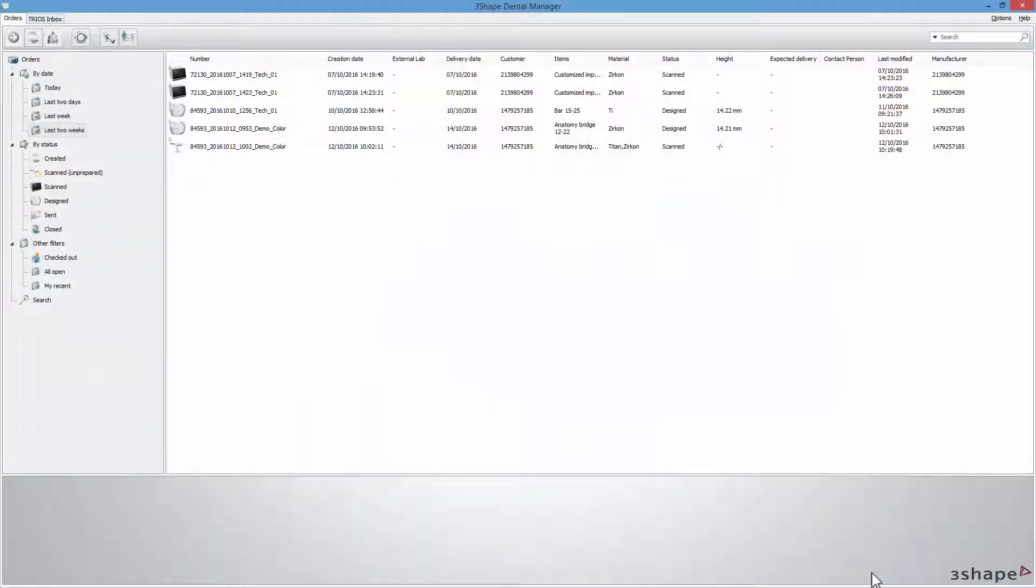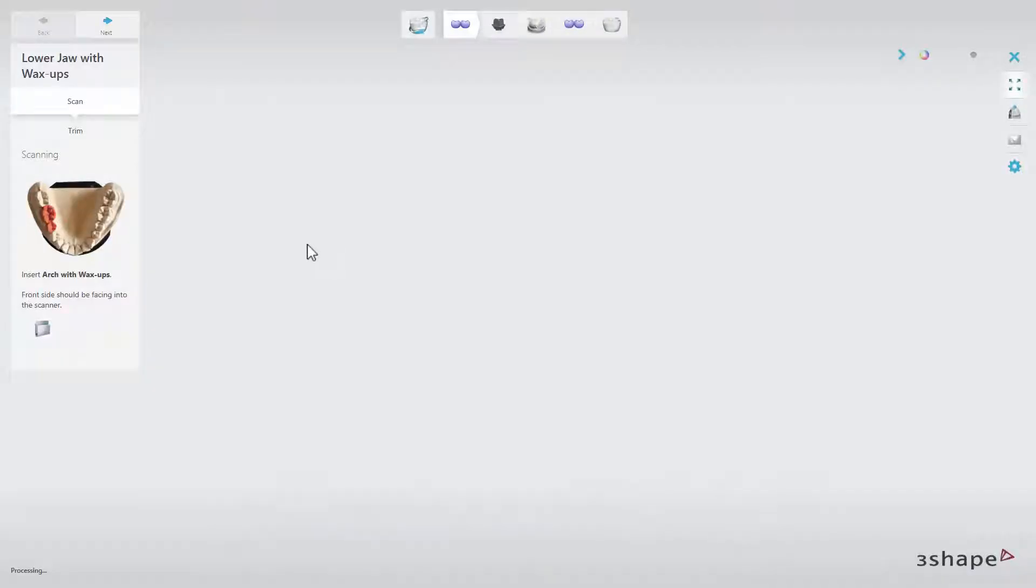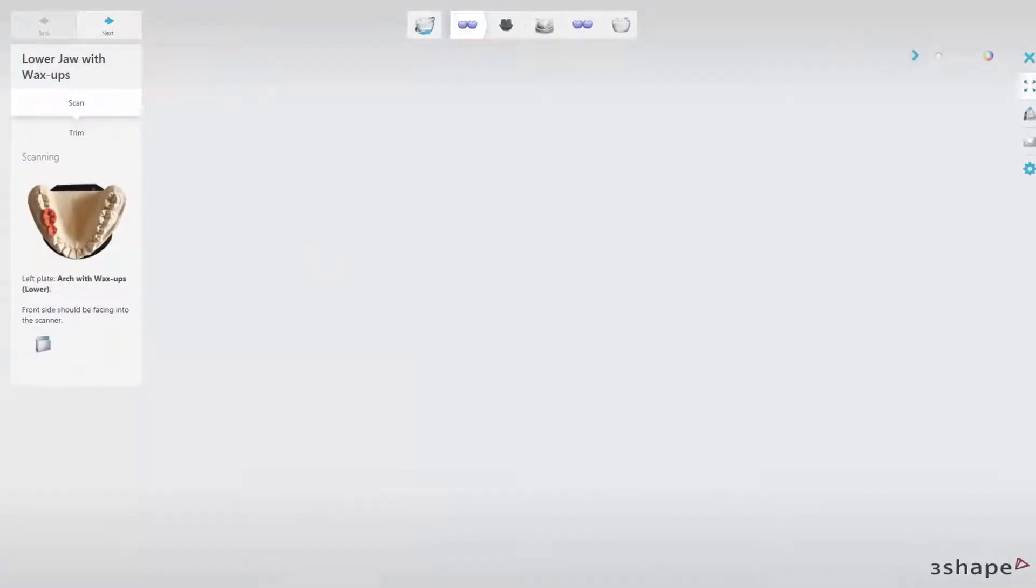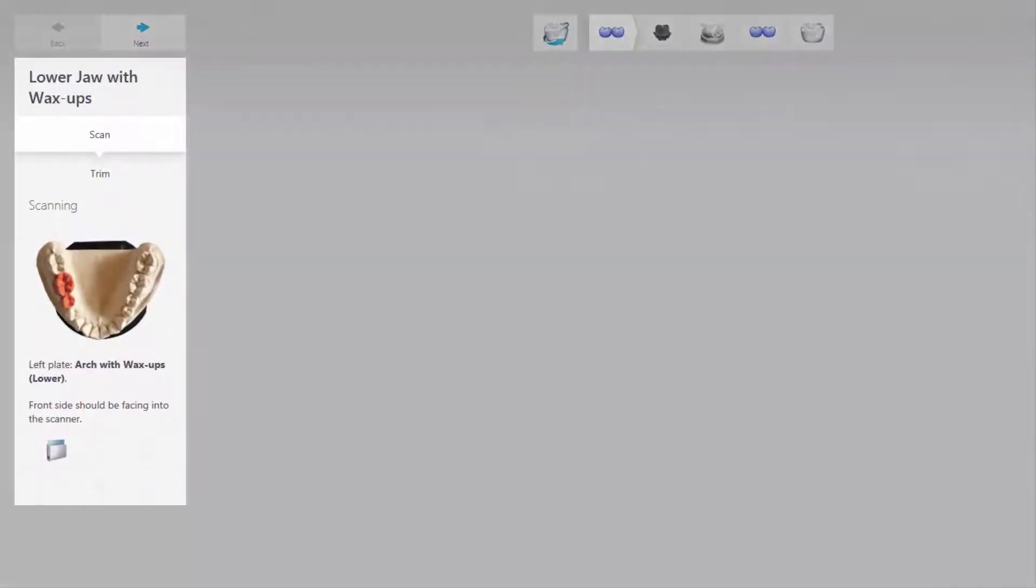The software will automatically take you to the Scan-It Dental scanning engine, where your scanning steps will be indicated on the workflow bar. The Overview window on the left will display scanning information.